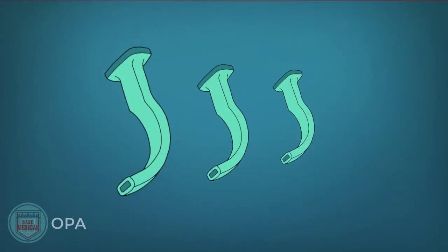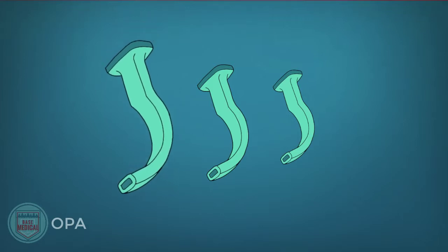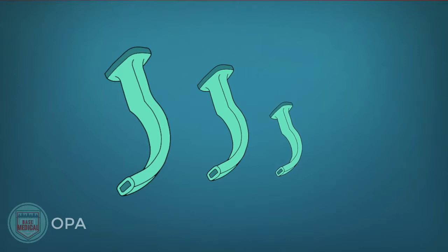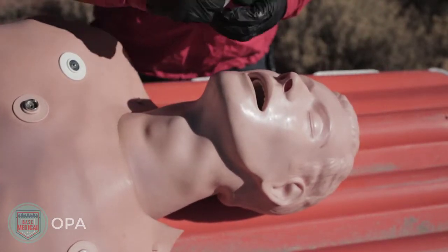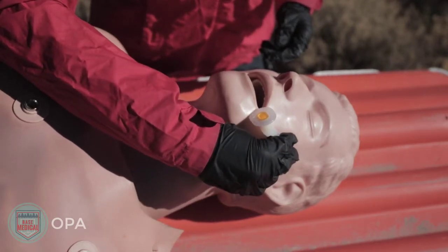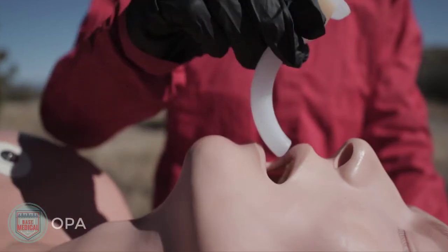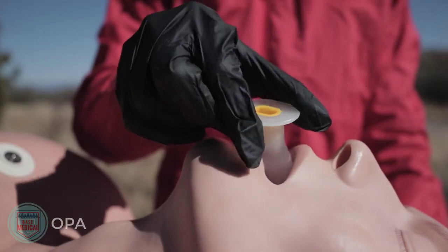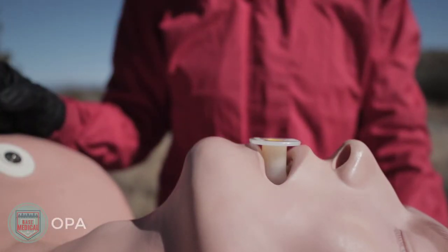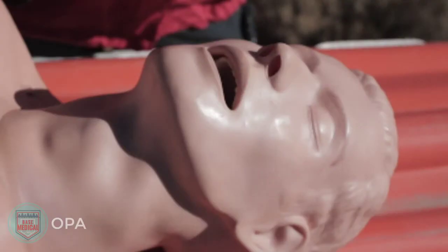The right sized OPA is very important. Too big can push the tongue back, blocking the airway. Too small can be a choking hazard and thus block the airway. Measure from the patient's earlobe, or angle of the jaw, to the corner of the mouth. Insert the OPA with the tip facing towards the roof of the mouth — be careful not to cause damage. Rotate 180 degrees so that the curvature of the OPA aligns with the curvature of the airway. The flange should rest between the teeth. An OPA can also be inserted at a 90 degree angle from the corner of the mouth.